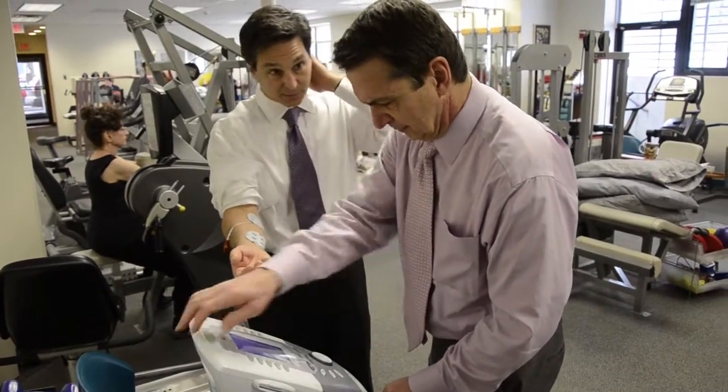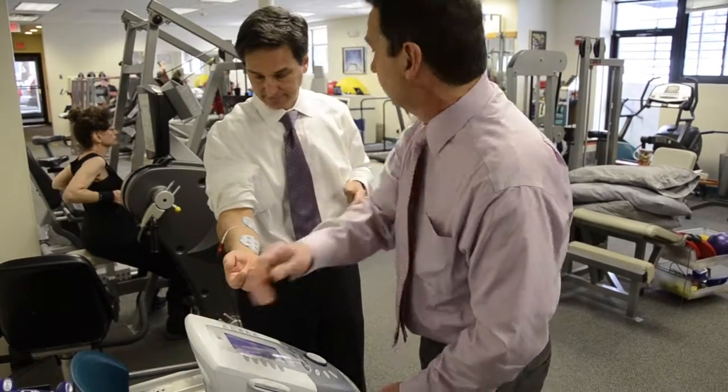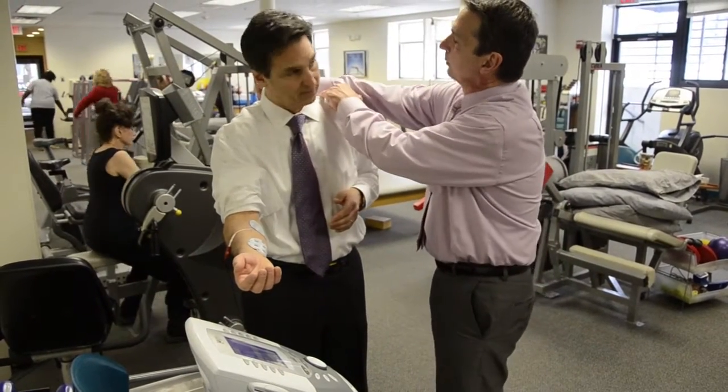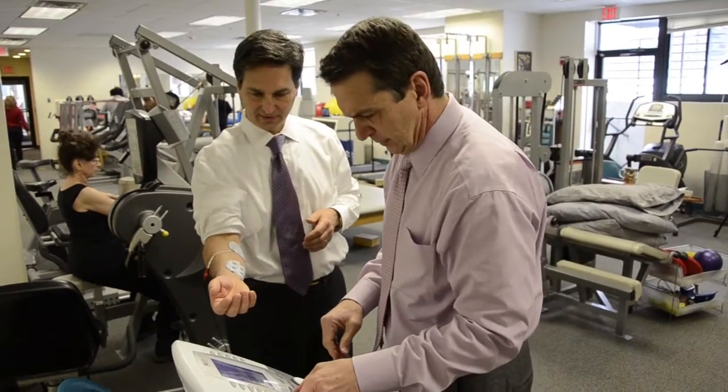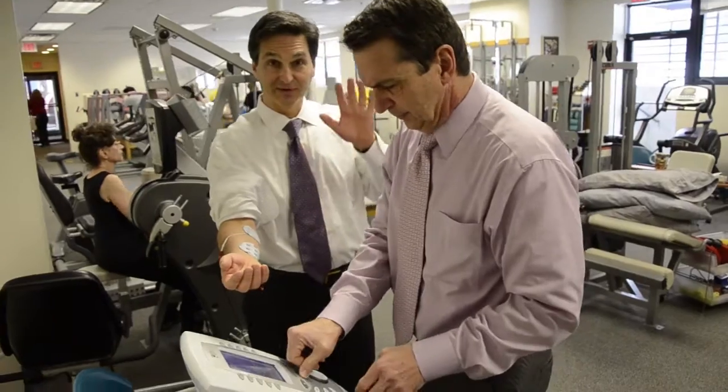So this obviously would go on the neck. If we're doing the neck, we usually use the upper trap and then some of the cervical paraspinals, but with the smaller electrodes.